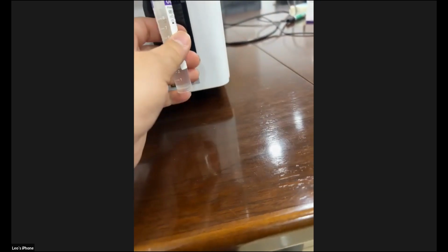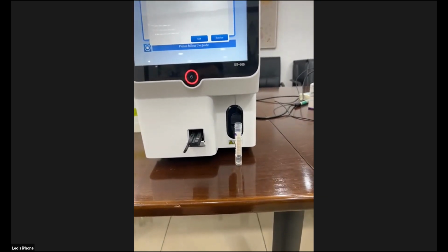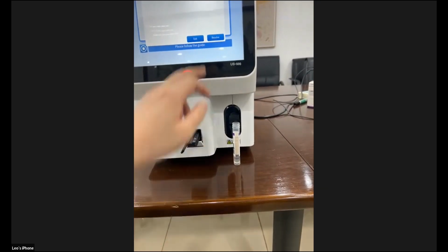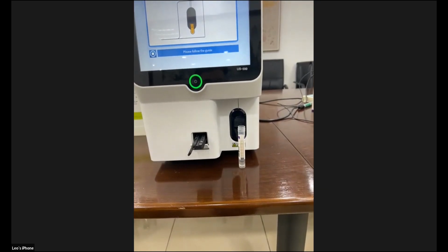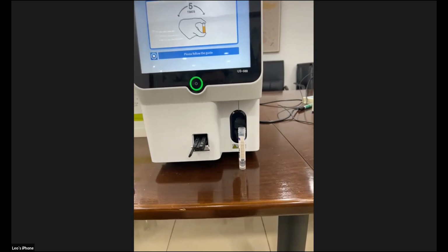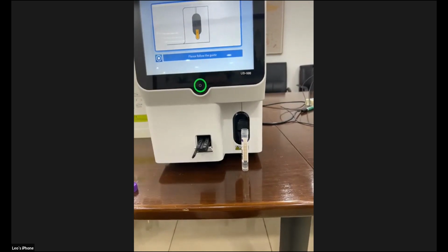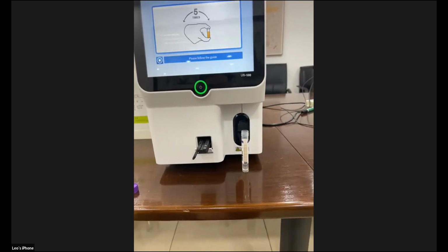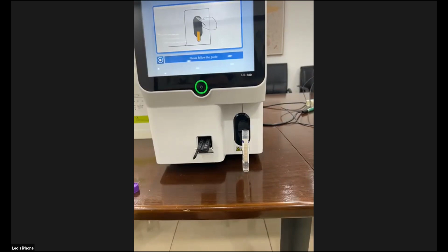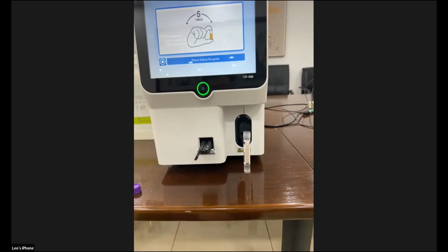Leo, yeah, I understand, but in some cases, this analyzer will be focused on low to mid-level customers. Those customers in my country don't use a collection tube which has a cap. They collect urine in a test tube which doesn't have any cap. So in that case, it will be very difficult for those customers to invert the tube and to shake.